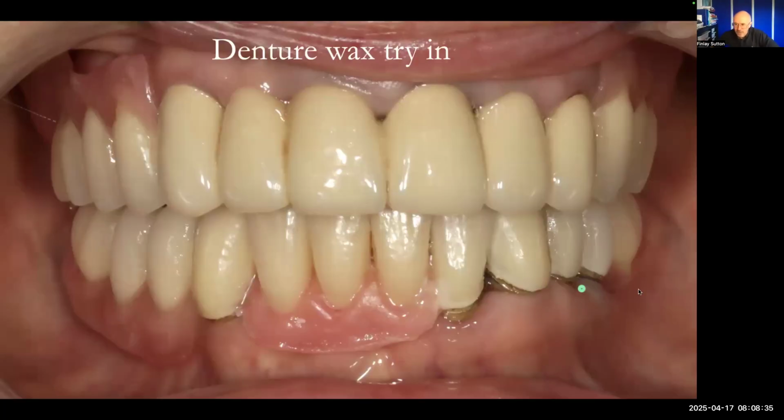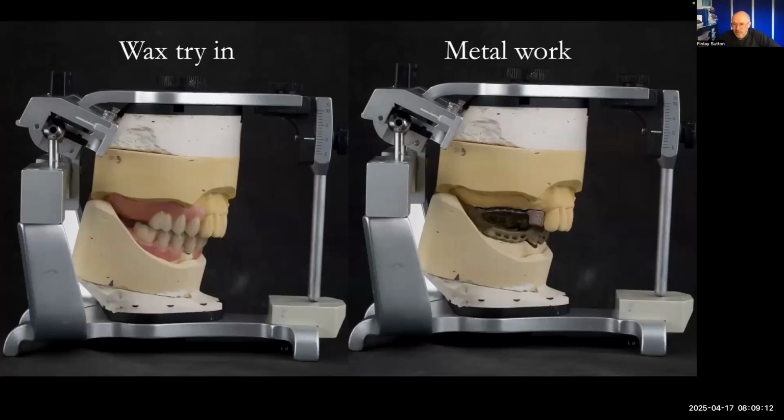I don't, AK, I do not care one little bit whether centre lines marry up upper and lower, because if you look at natural teeth, they very, very rarely do. So not an issue at all. I'm just not bothered. And in fact, I have never had a patient yet worry about centre lines marrying up. Having said that, though, I might have someone next week that talks about it. So, no, centre lines just not an issue for me. I don't care about them at all. But it's an interesting point, AK.